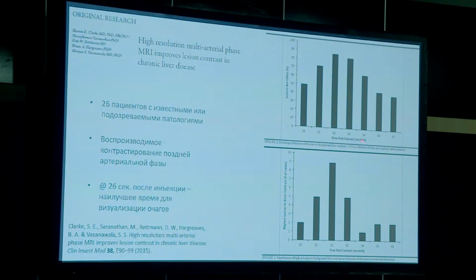If you look at that chart, you can see that roughly around 26 seconds post-contrast injection, the highest number of lesions was visible. If you go 8 seconds earlier or 8 seconds later, there is only a fraction of lesions that is visible.